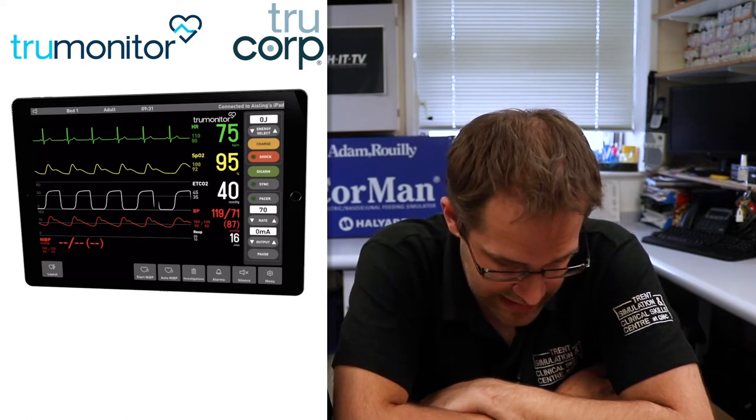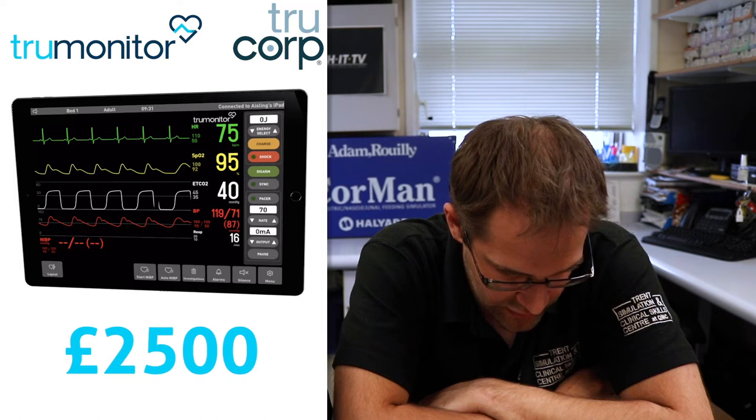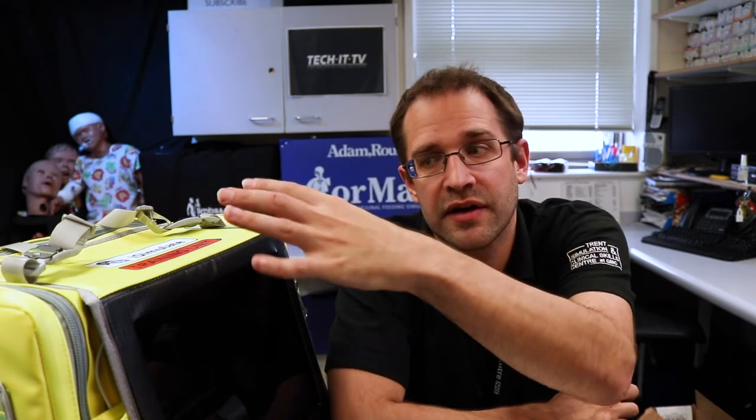There are other products available that do a similar sort of thing, and we'll hopefully do reviews on these later. The first one to mention is True Monitor from TruCorp, priced at around £2,500. It's a similar setup — two iPads controlling one monitor — the software itself is around £2,000 and you have to buy additional pads separately. So it doesn't come as a complete package with iPads, router, defib pads, and SATs probes all included, which is why the iSimulate is more expensive.